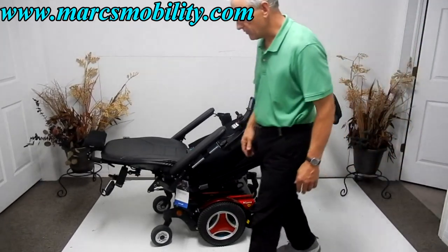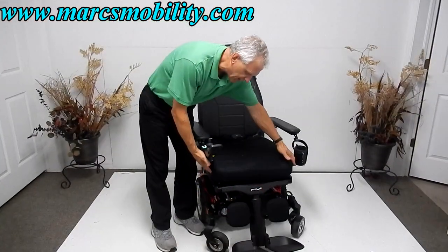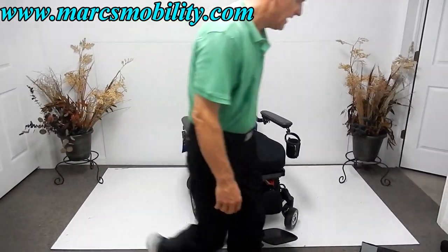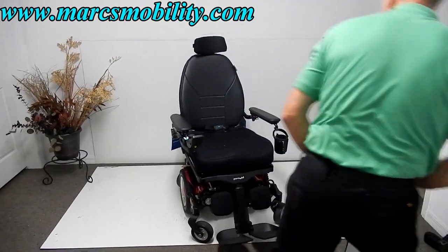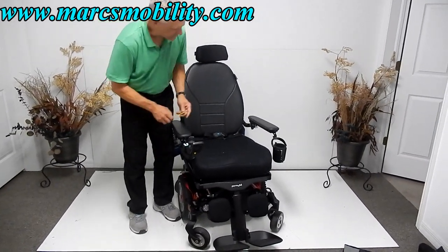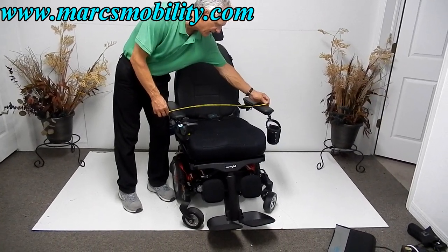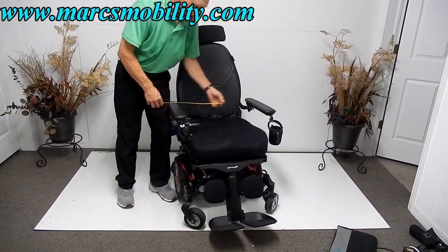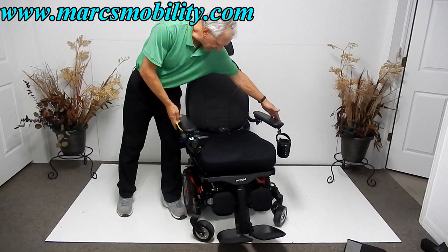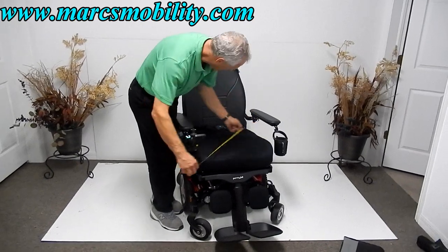There you have the electric recline and electric legs together. This chair is 22 inches wide by 20 inches deep. On these big chairs, remember: the base is probably 26 inches wide, but from outside arm to outside arm you're at 30 inches. Inside the arms you're 21 inches. So 21 inches inside the arms, 30 inches outside — that's what you need to keep in mind to get through a standard door.